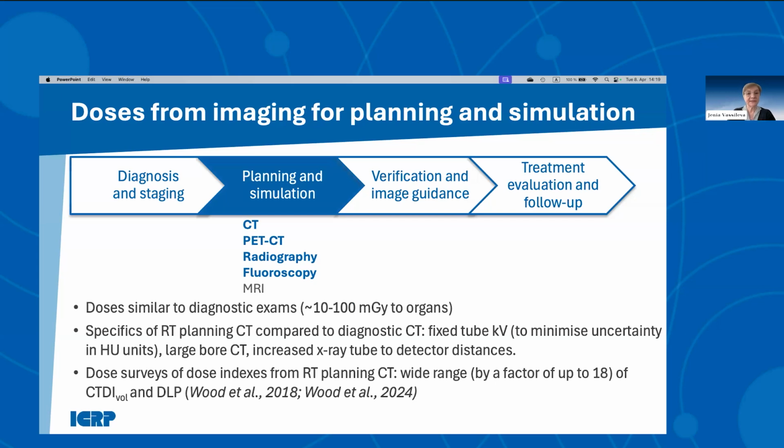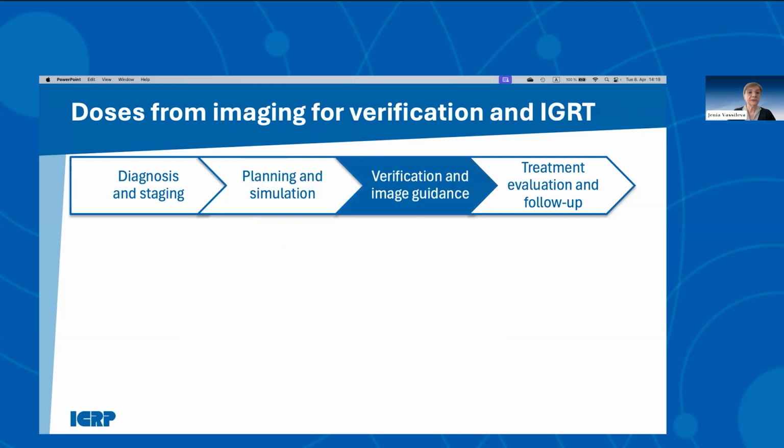And audits performed in the UK, for example, showed large variations of the doses to patients for the same protocols, but in different centers.